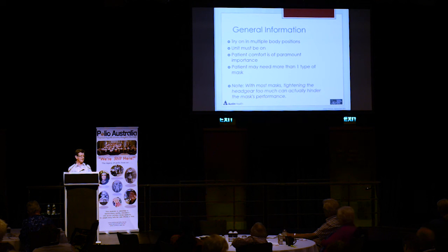And many of our clients have multiple masks. They might have a nasal mask or a nasal pillow system to use during the day, and then a full face mask to use at night when they're unable to control their mouth opening. So there's lots of different things.